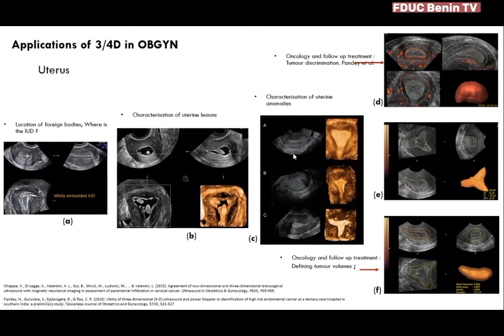The uterine structure can be studied in more detail. So we have all the acquisition, and pay attention to the reference reconstruction line, which is bent to cut through the endometrium, and this is the resultant reconstructed image.